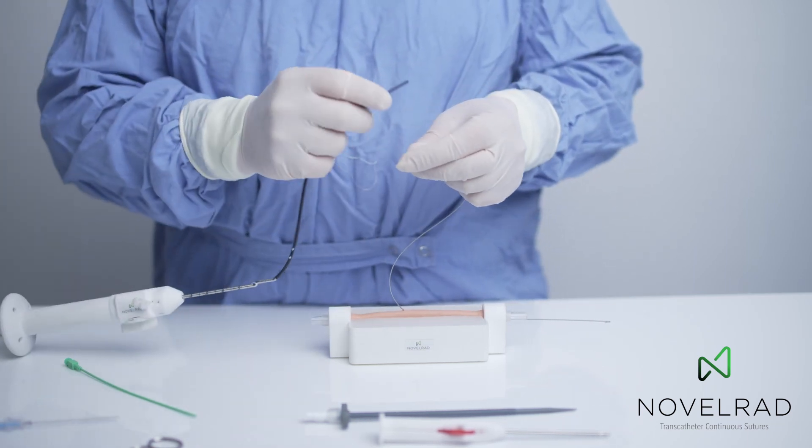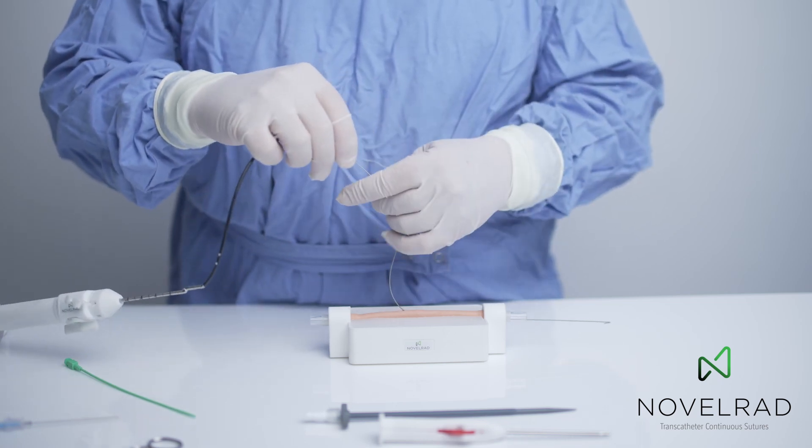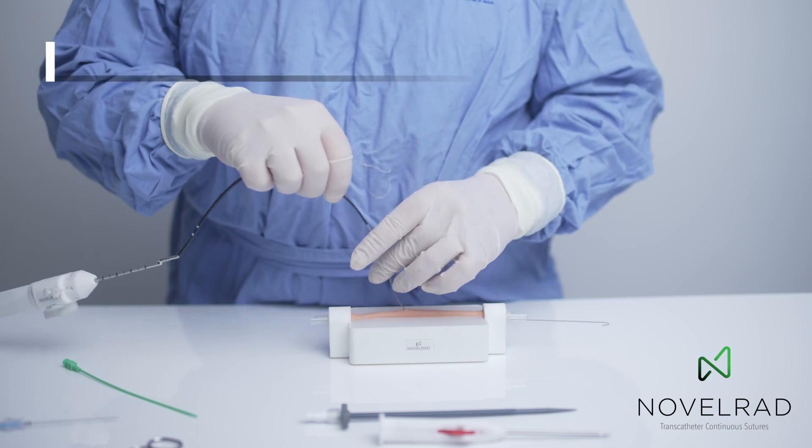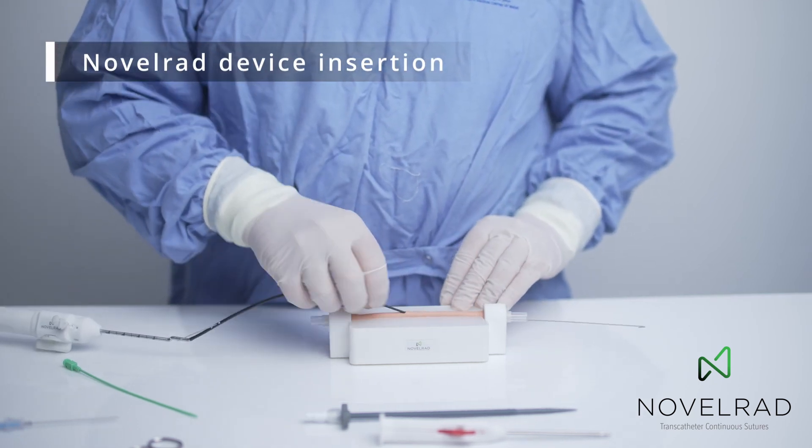Here we take the long dilator of the Novelrad device, similar to a Perclose device, and this is advanced along the guide wire into the vessel.